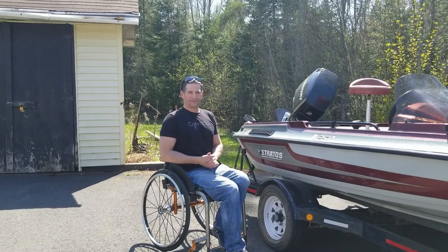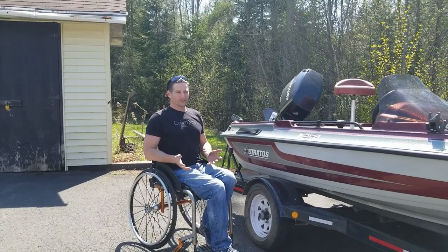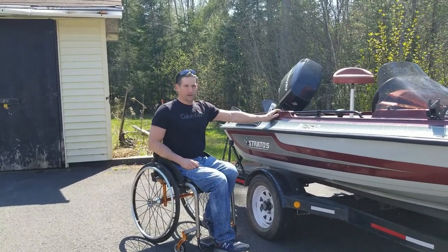Hey everybody, thank you for tuning in to Paralife TV. Today I'm going to show you how I transfer onto my boat.